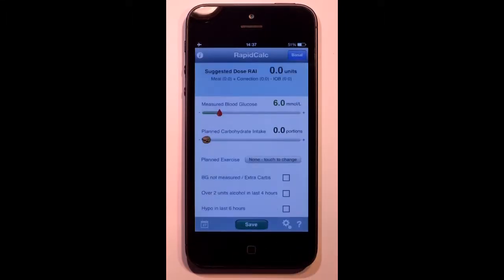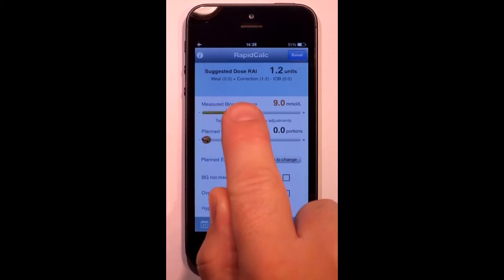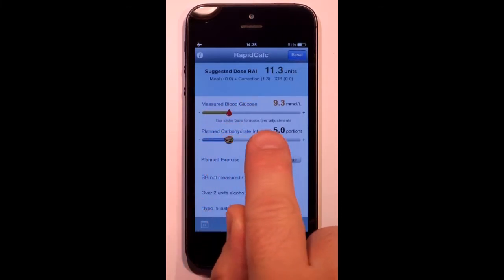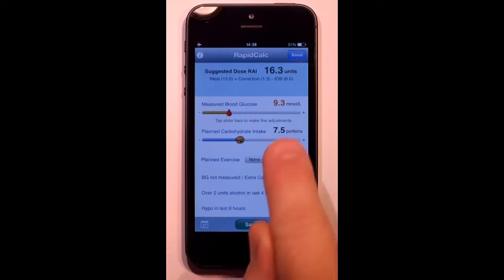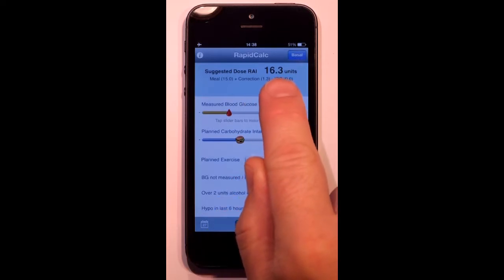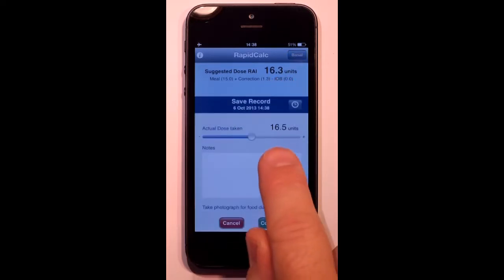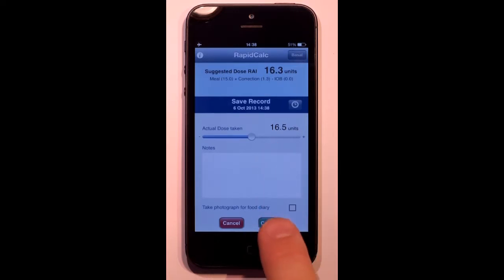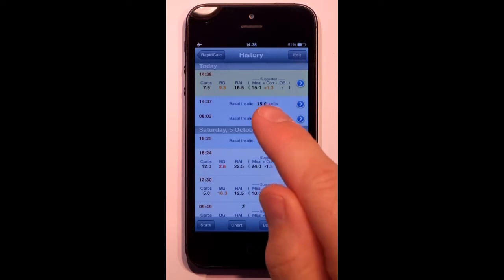When dosing for a meal, I just enter my blood glucose reading, my planned carb intake, and my dose is calculated up here. Once I save the record, RapidCalc will automatically round the dose up to match my pen. Once I confirm the dose, it goes into my history.